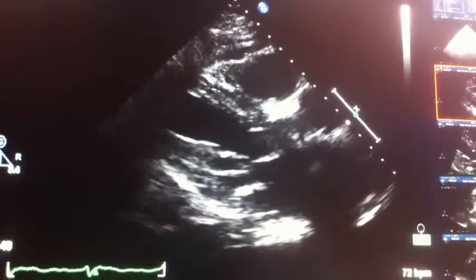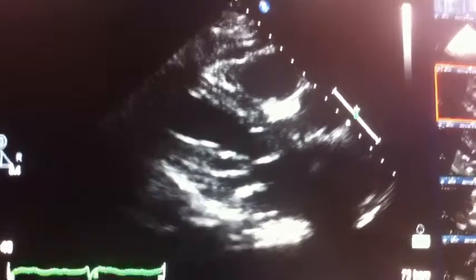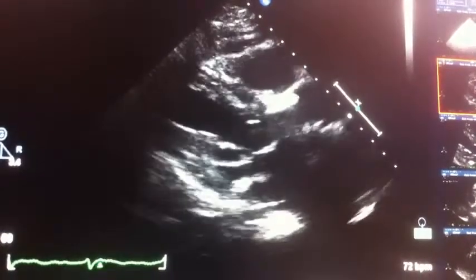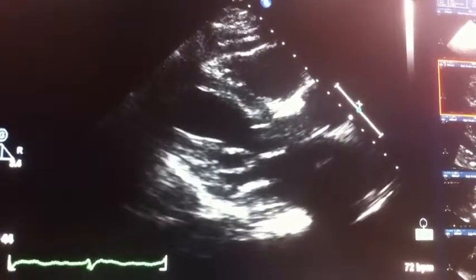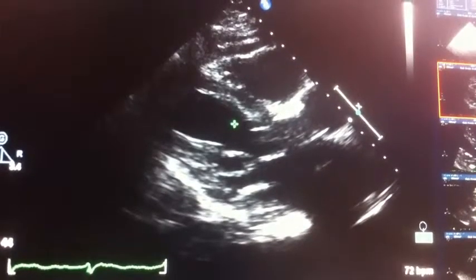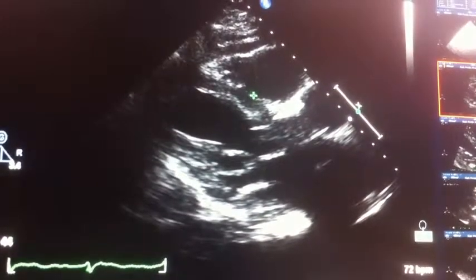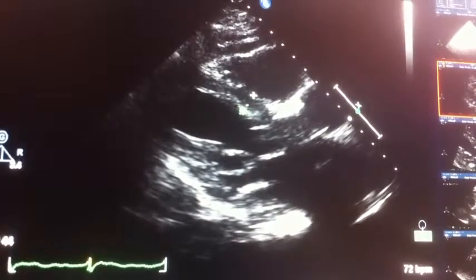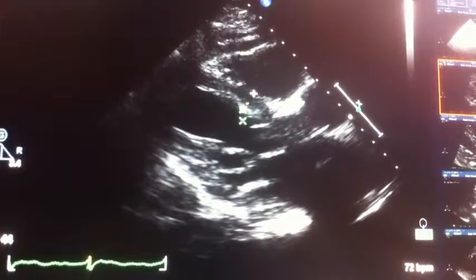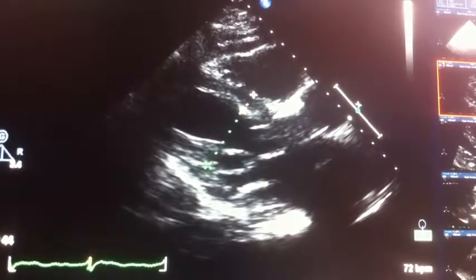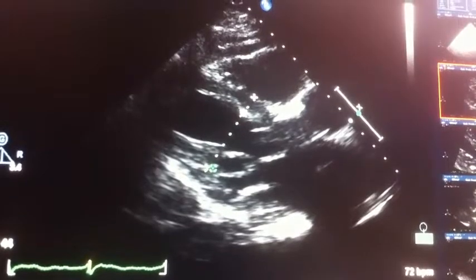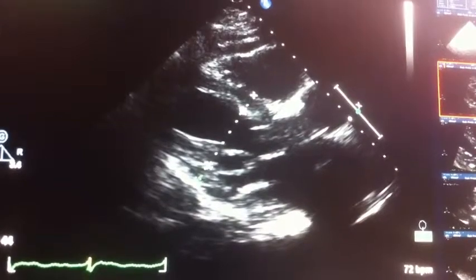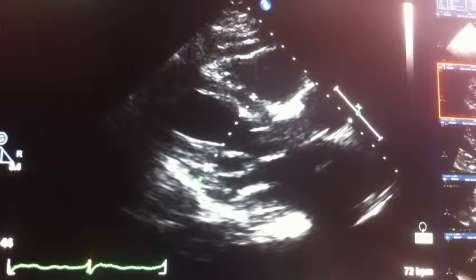I'll freeze this image and then scroll back to a certain part of the cardiac cycle. Then I can pull up calipers to measure the thickness of this wall, this chamber dimension here — just spatial measurements — and this last wall here. That's one example of things that we'll do with calipers two-dimensionally.